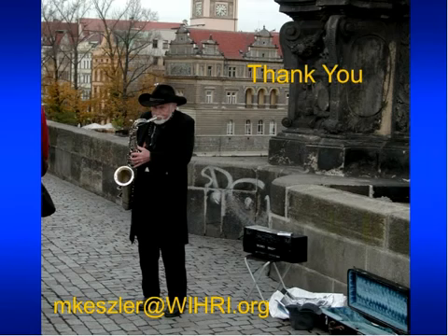Thank you very much. The other issue that we respiratory therapists have been dealing with for decades in our nurseries is the basic 4 different sizes of endotracheal tubes that we have that are uncuffed, and the 4 sizes have to fit everything from our ridiculously low birth weight babies up to our post-term kiddos who are relatively large. With volume guaranteed ventilation, volume targeted ventilation, how detrimental is that endotracheal tube leak to achieving the goals of that mechanical ventilation mode?